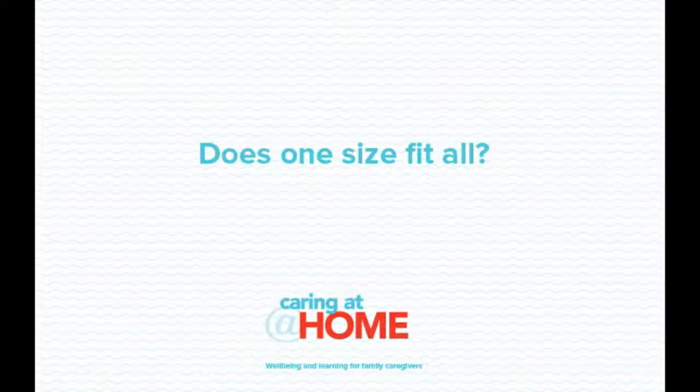Does one size fit all? Urodomes come in different sizes, diameters and lengths. Your local district nurse or continence advisor will be able to measure you up for the right urodome size. When applying a urodome it's useful for the gentleman to be sitting on the edge of a chair or bed to apply the sheath.